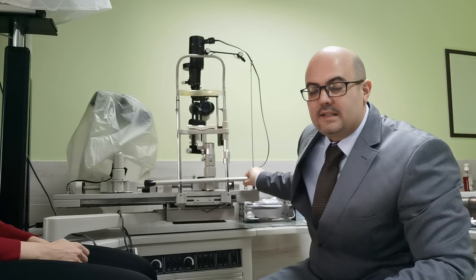As-salamu alaykum wa rahmatullah. Dr. Khalil al-Salem with you. Insha'Allah, today I'm going to talk about the slit lamp.